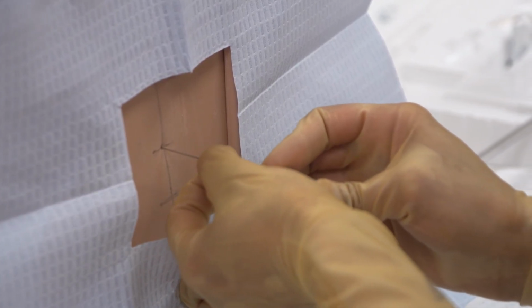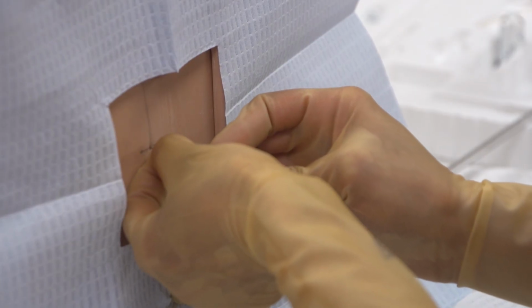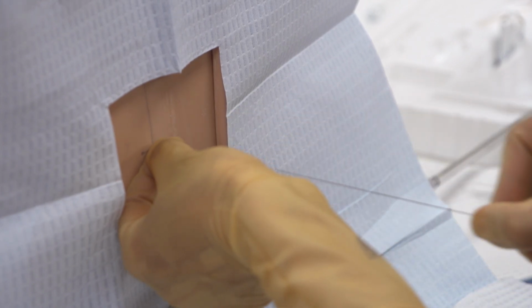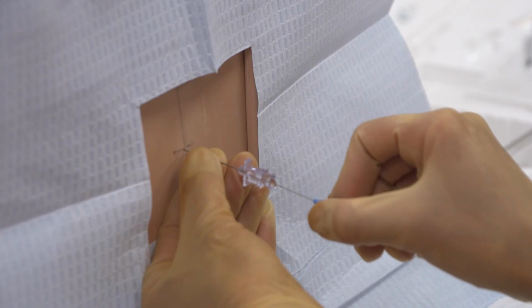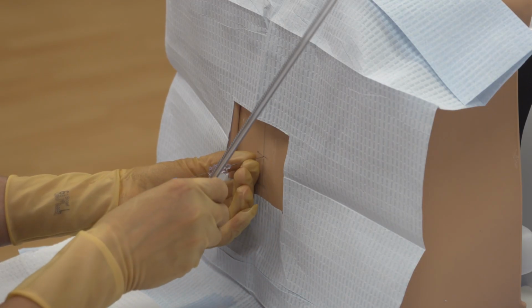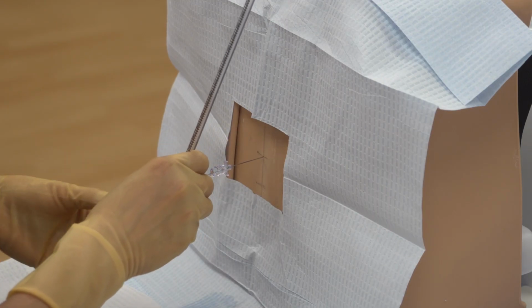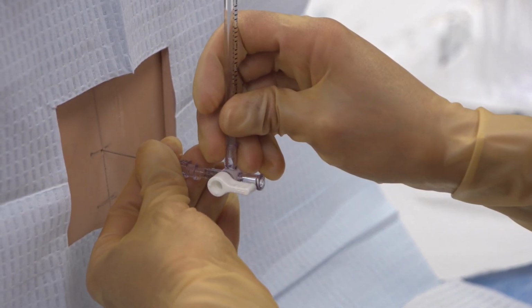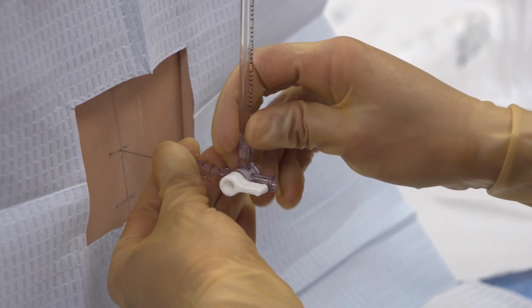Once you have reached your anticipated dural depth, begin checking for CSF flow in 2 to 3 millimeter increments by removing the stylet completely and replacing it all the way before further advancement. Once you have confirmed CSF flow, replace the stylet halfway into the needle. If opening pressure measurements are desired, place the prepared manometer onto the spinal needle after removing the stylet completely. Avoid excessive pressure when connecting the manometer complex to the spinal needle itself, as this may displace the spinal needle and make removal of the manometer more difficult.